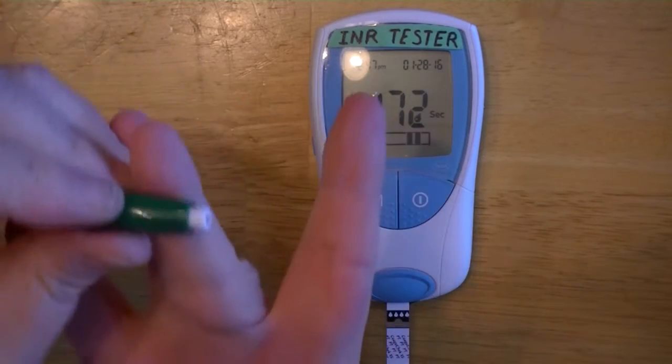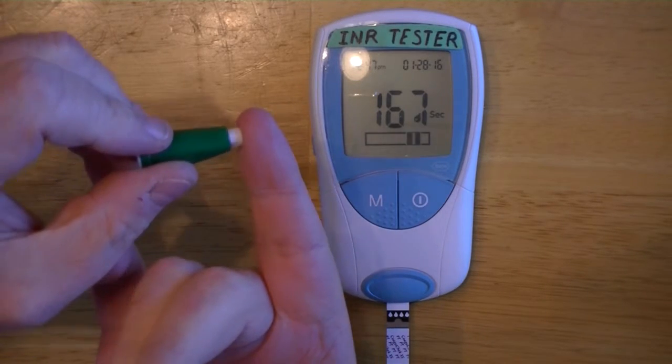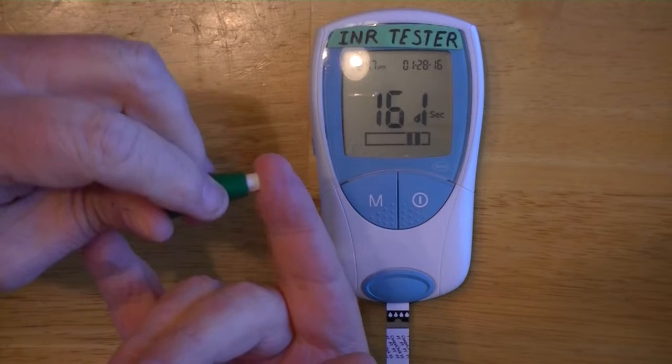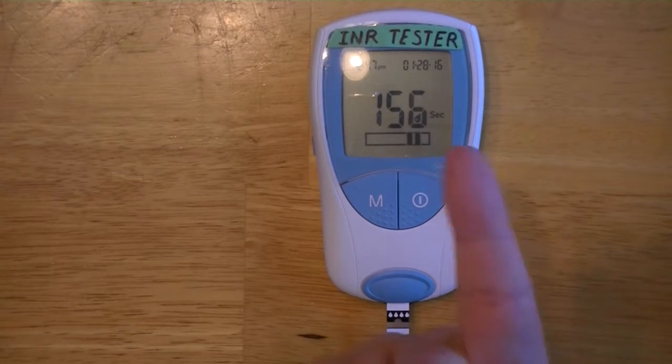You find a suitable spot on your finger. I find it's generally better not on the side and not in the very middle, but somewhere between the middle and the side — that usually gives the best results. I'm going to stick this in and then let the lovely Vanna here go ahead and milk my finger.